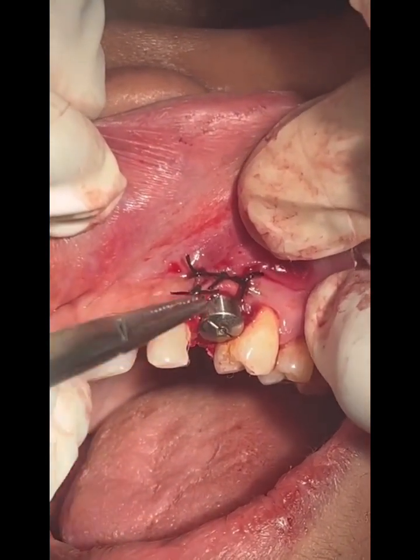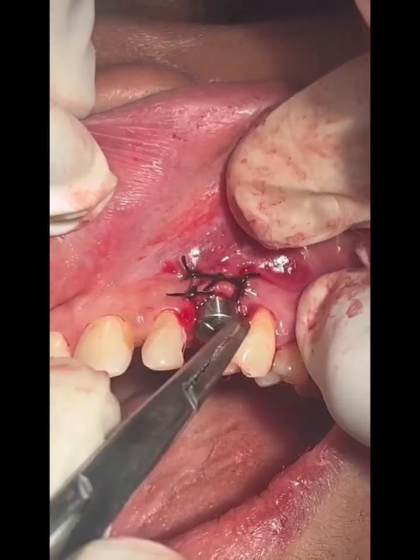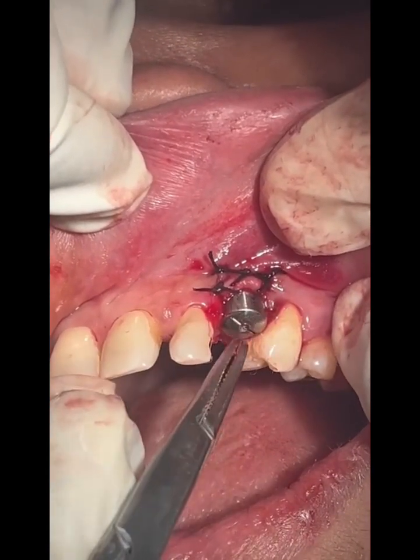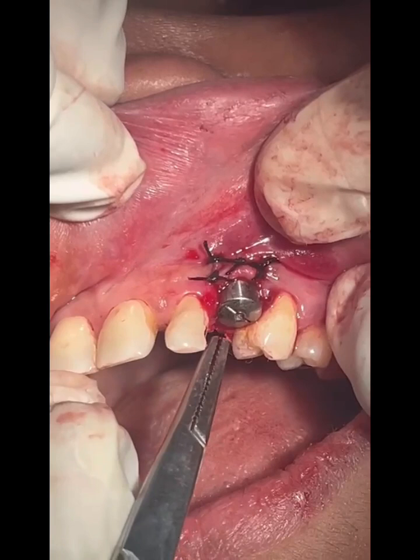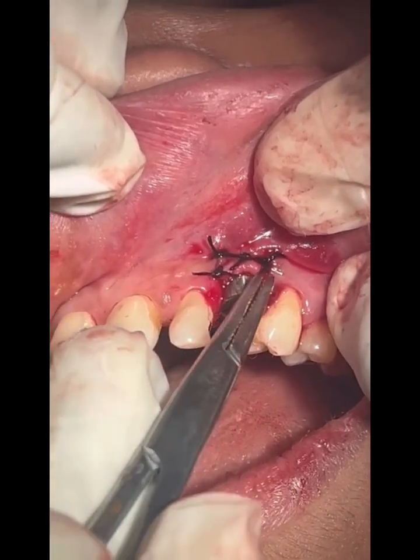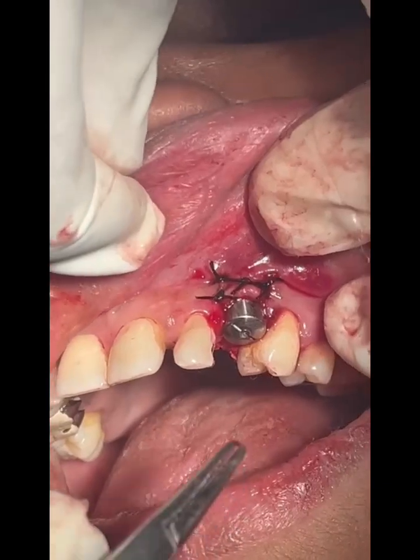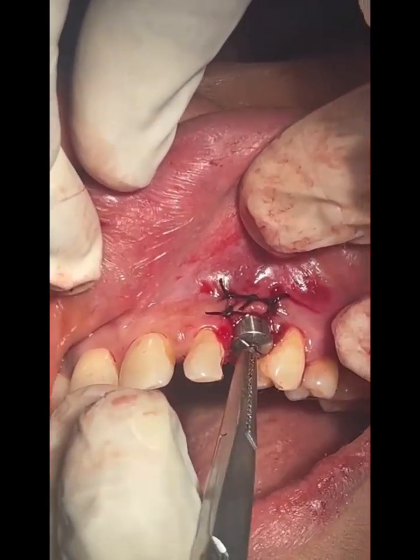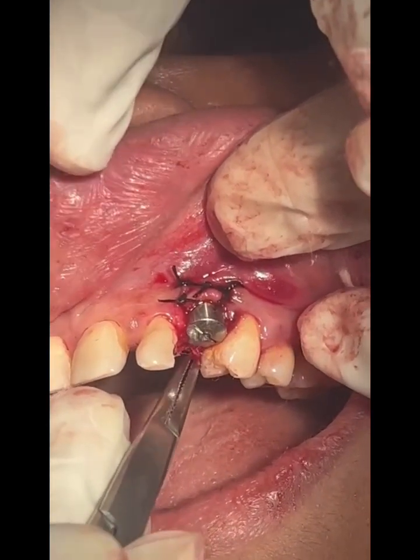The thicker the peri-implant mucosa, the lesser is the chance for peri-implantitis or peri-implant mucositis. So we expect to get a good mucosal coverage here with enough thickness that it will support this implant, which has got bone from the distal area, from the mesial area and from the palatal area very much, but on the buccal side the bone is much less, or you have a membrane of bone over the implant, which is a good indication. The rest is, we'll be showing you the follow-up as we proceed with the process.